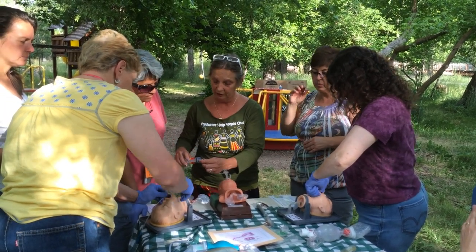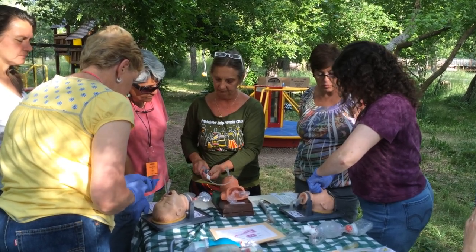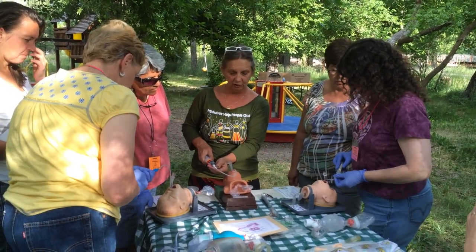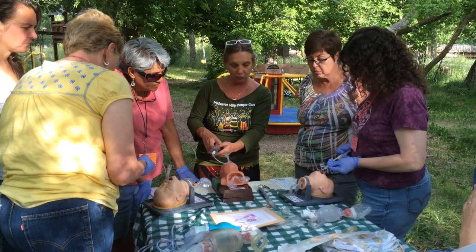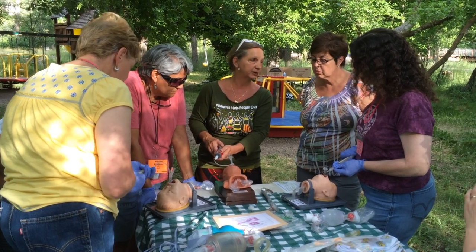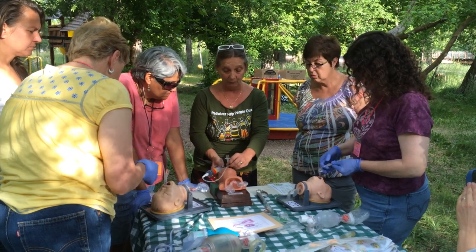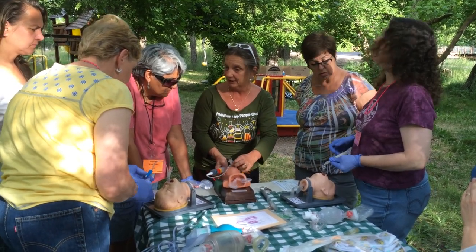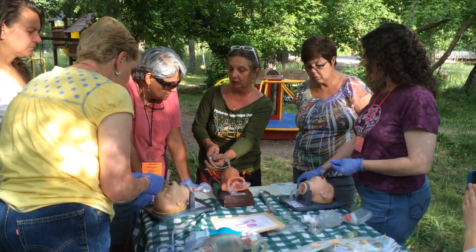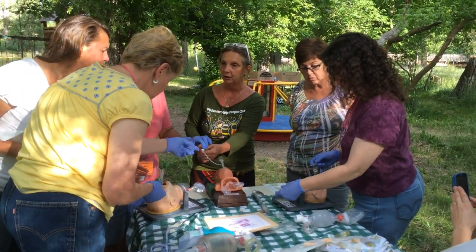And then you go ahead and refill it with about 3/4. Oops, mine took the ear out. But that's why you leave it full. And then just until it's smushy. Watch. If you put too much air in, it's going to pop up. See? If it pops up, it's not where it belongs. So you don't want to fill it totally full. If it pops up, you want to go back and push it in a little bit more. So you only want to put in about 3/4. Don't go to that point. Just go to when it's nice and, as I say, smushy. It's not hard and it's not flat.